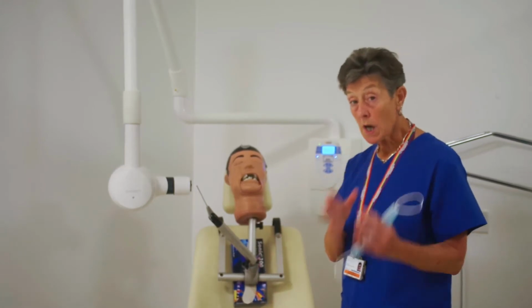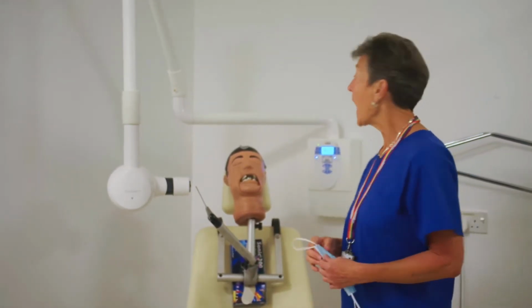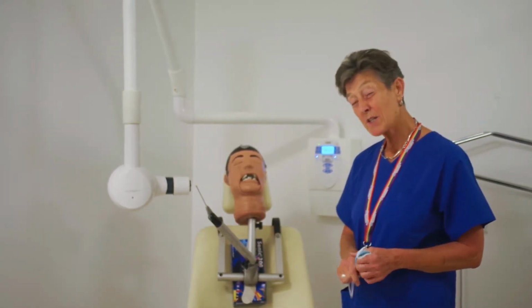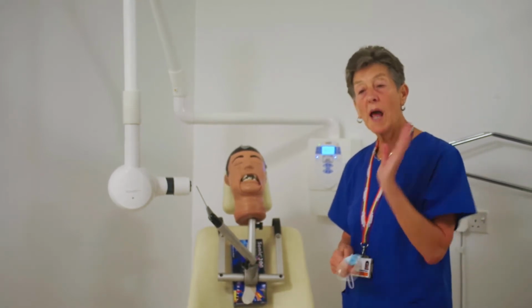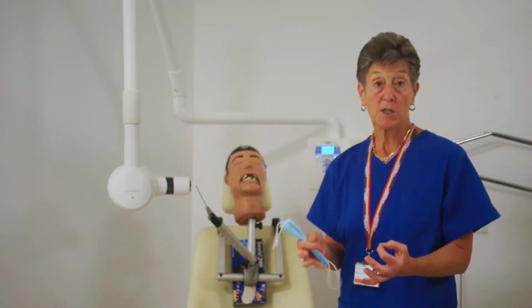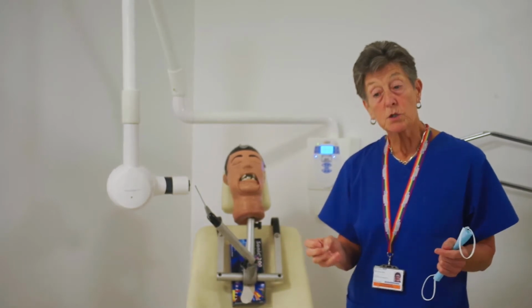It reduces the time of the radiation exposure time, and it does have an unfortunate effect that it reduces the contrast of your image, but it is a trade-off between quality and dose. So there are lots of other ways of reducing the dose of the patient.